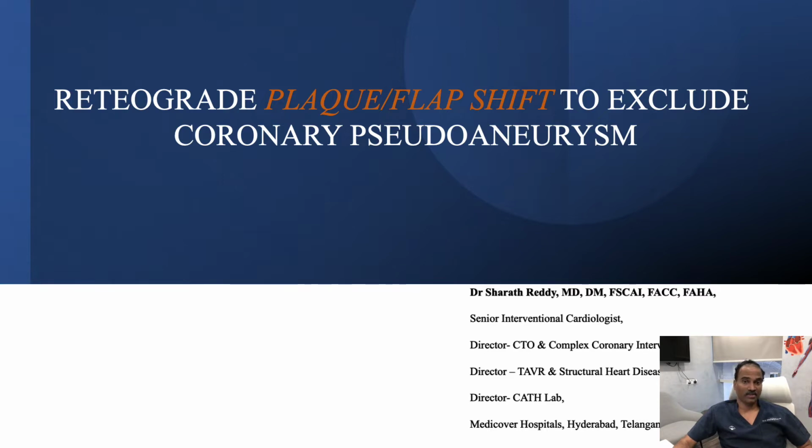Today I'm bringing up a good case of pseudoaneurysm, coronary pseudoaneurysm, which was closed by retrograde plaque or flap shift.